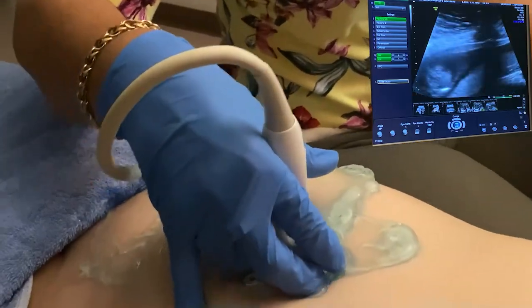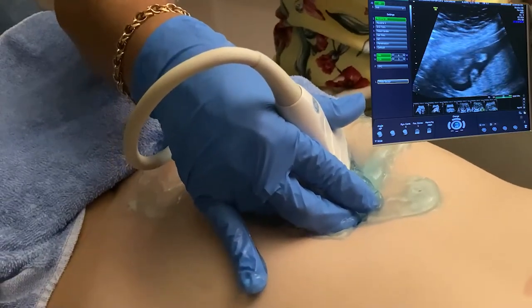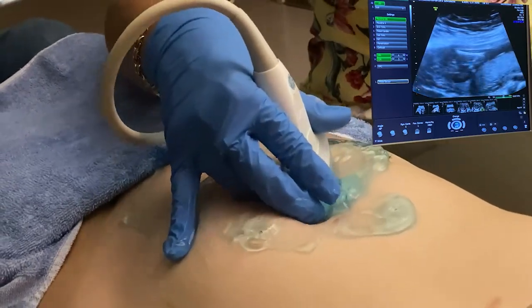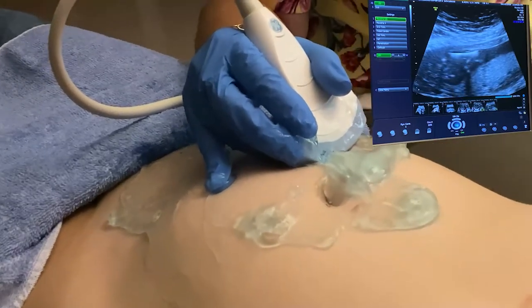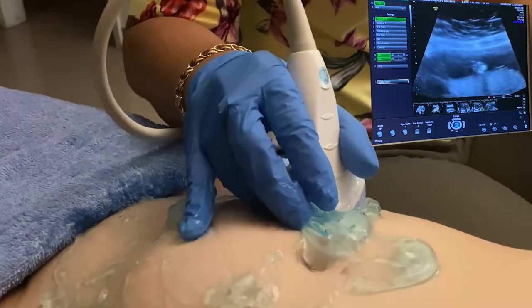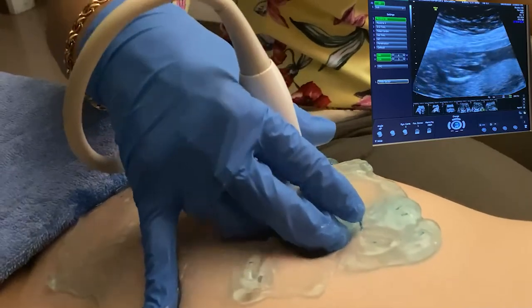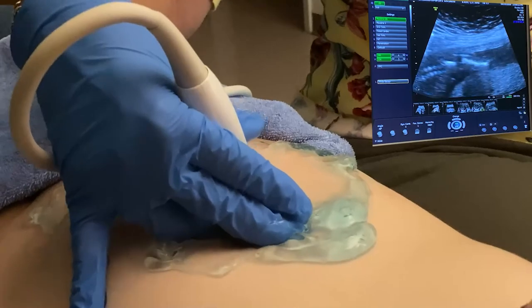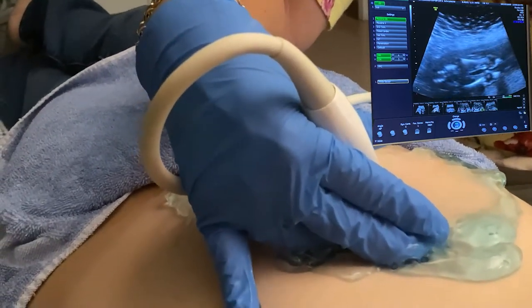And that means you don't want to foreshorten or elongate it by having it off angle like this or like this. Because even from here, it's just a matter of rocking your transducer ever so slightly, even when this baby is very active, and thankfully we have CineLoop that we can go back and get it as straight as we possibly can. If you don't have CineLoop, then I'm sorry. But CineLoop is extremely useful.